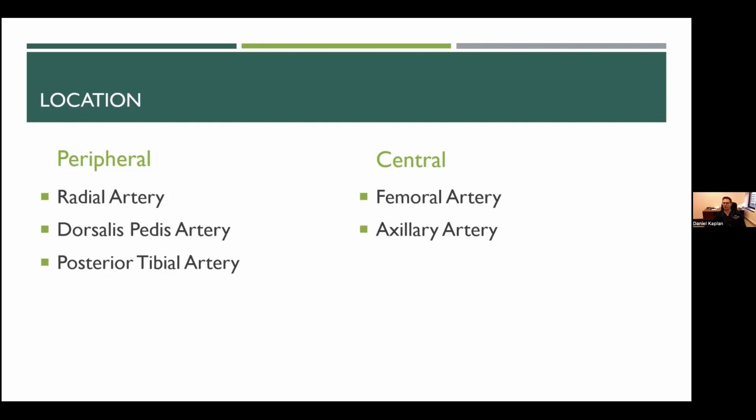When you need to put in a central arterial catheter, your femoral artery and your axillary artery are your 2 big options. You run into a little bit higher risk because these don't have significant collaterals. So you do worry about if you develop a clot or large hematoma, compromise to that extremity. However, in situations where patients really clamp down or they're in shock, it can be difficult to get a peripheral arterial line in the amount of time that you want, so you can go straight centrally. The axillary artery, you also could get concerned about injury to the brachial plexus in the area, especially if a hematoma develops, you can have compression of your brachial plexus.